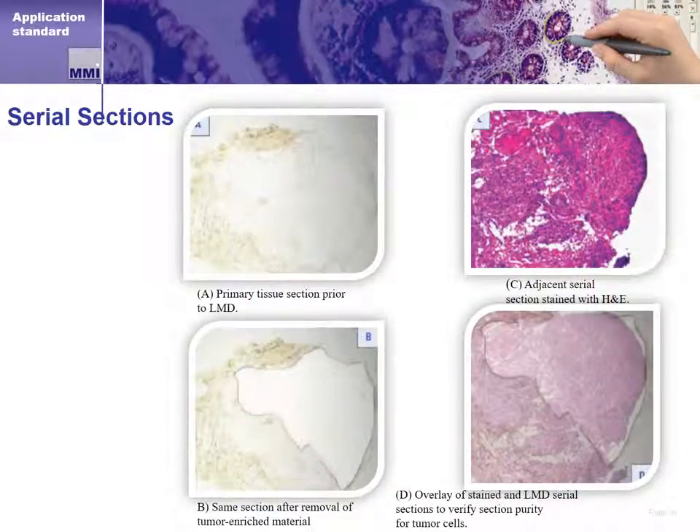Here we see images used when capturing unstained tissue sections with the MMI CellCut. The top two images show us the unstained and stained sections. The stained section is our roadmap while the unstained section is the section we'll dissect. The bottom left image shows us the dissected section from the unstained tissue sample. The bottom right section shows us an overlay of the unstained, dissected tissue on top of the stained tissue. This confirms the accuracy of our dissection.